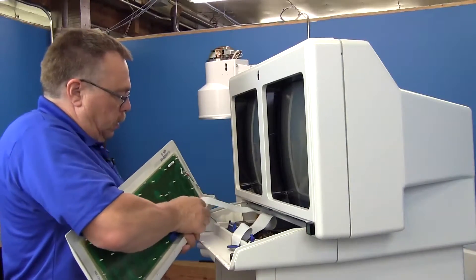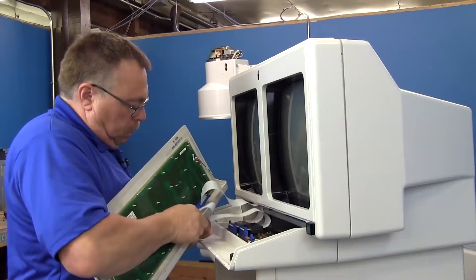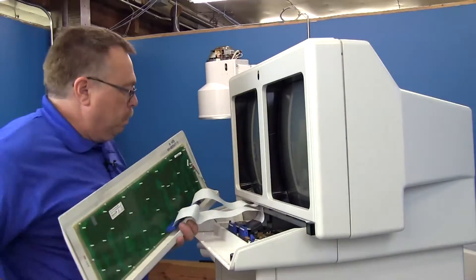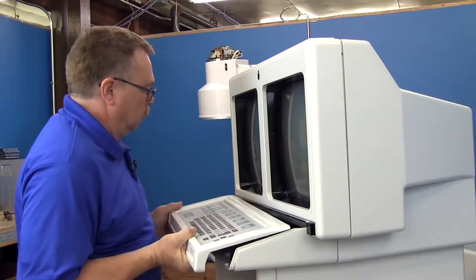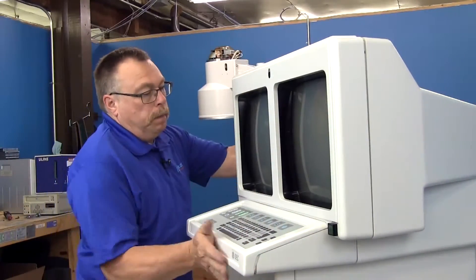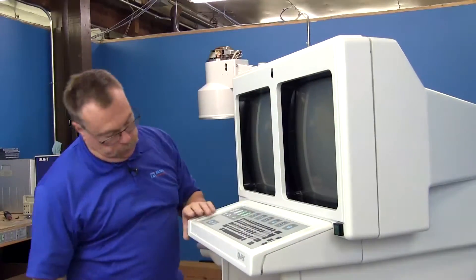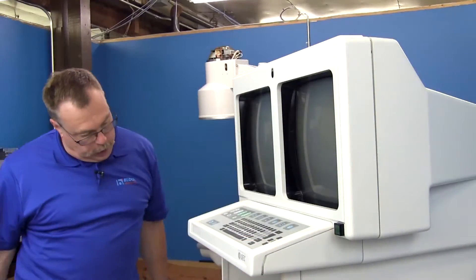Once those screws are in, move on to your keyboard. There are two connections here. Line it up and push it back in, then put the six screws back under here and you're all set. That's it for the OEC 9800 power on and off switch. If you have any more questions or concerns, please feel free to contact us at blockimaging.com.